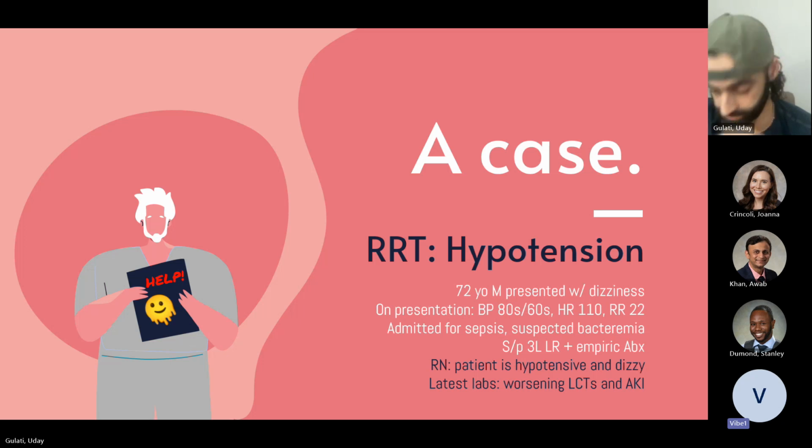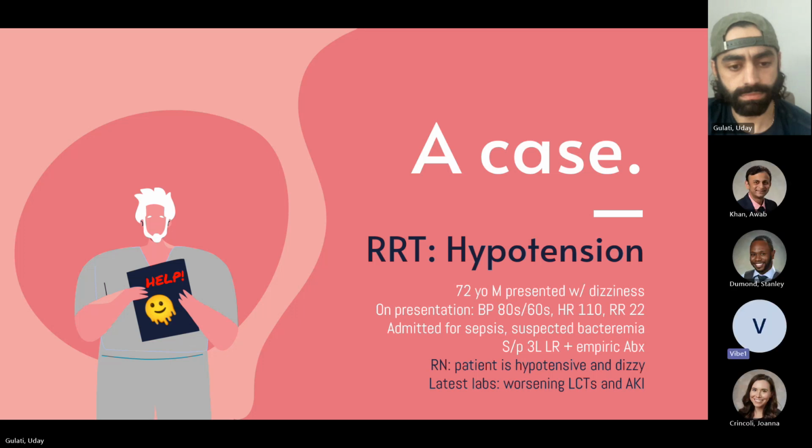Assess his mental status. His BP is low at this time, so that's my most concerning thing. I want to stabilize the patient, get some collateral information from the nurse, and probably start him on some fluids for the time being to buy myself some time to figure out what's going on. If you have the ultrasound there, which I know is the point of this lecture, you could start a point of care ultrasound exam.